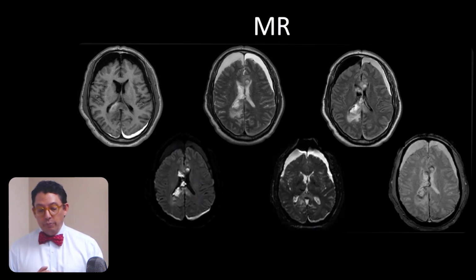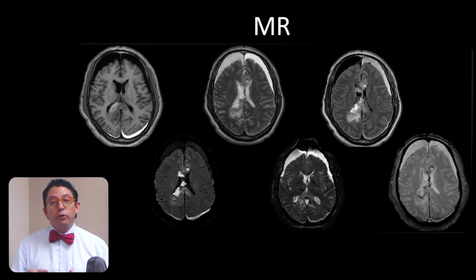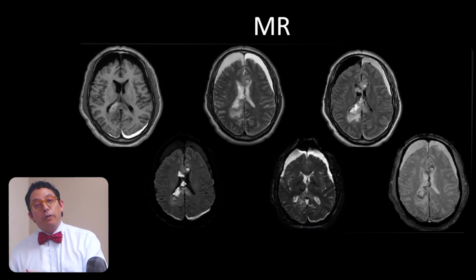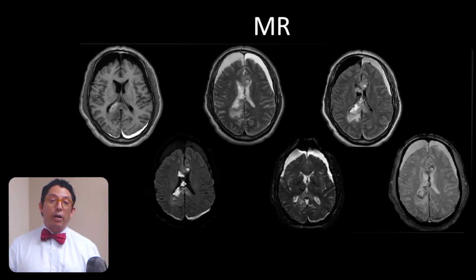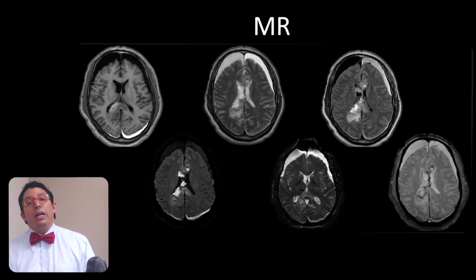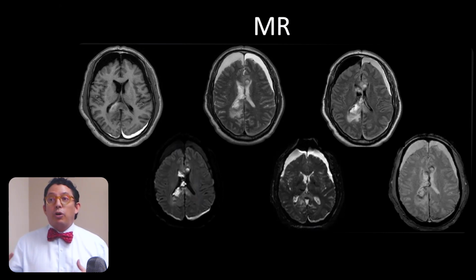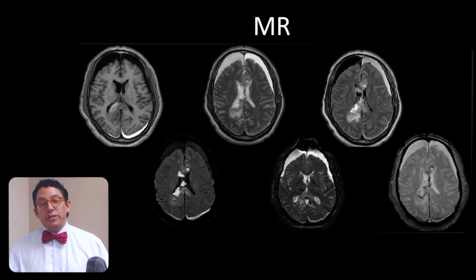So it's different how you see blood products in an acute phase, in a subacute phase, in a late subacute phase or in a chronic phase. And MRI is much, much better than CT to date the bleeds. This is important not only to know how to treat a patient, but for example, to know, if a patient that was hospitalized fell, which component of the bleed was due to the fall and which was an old bleed that he already had. That's a case.